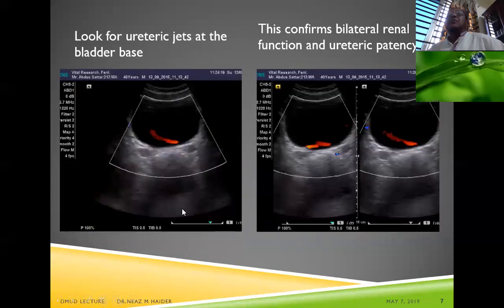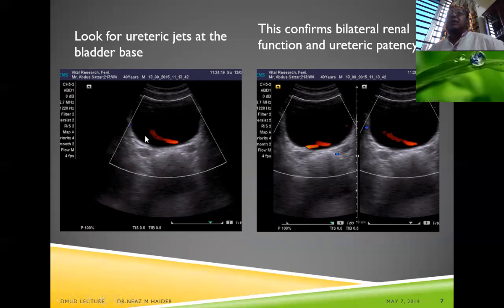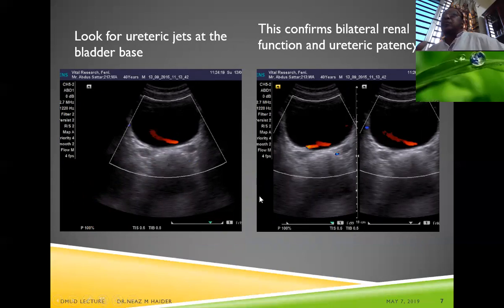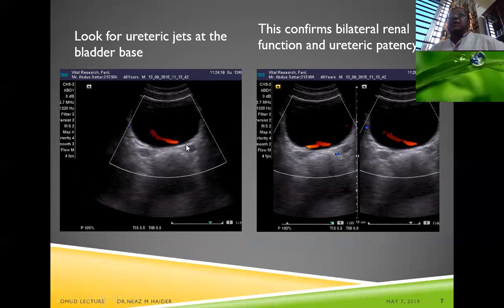We can visualize the ureteric jets by placing the color box at the vesicoureteric junction. The left and right ureteric jets can be identified. Even without color Doppler, the flow of urine into the bladder can be seen in grayscale.